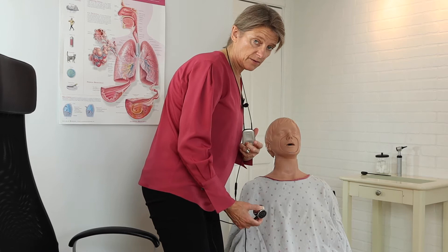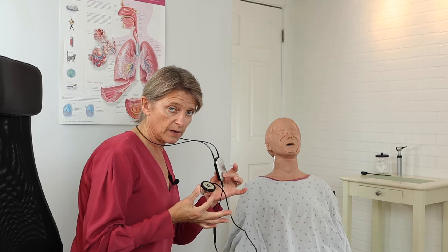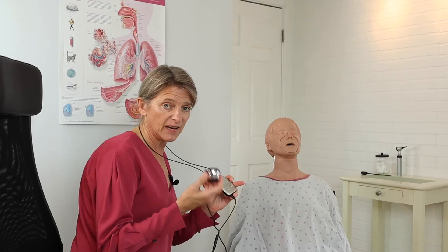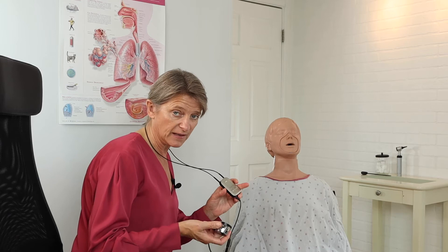One of the benefits of using this — even though I have the stethoscope connected to my streamer — is that I'm still able to use the microphone on the Phonak Compilot 2, so I can still hear the patient. If he starts to talk to me for whatever reason, I can talk to him while I'm using the stethoscope.